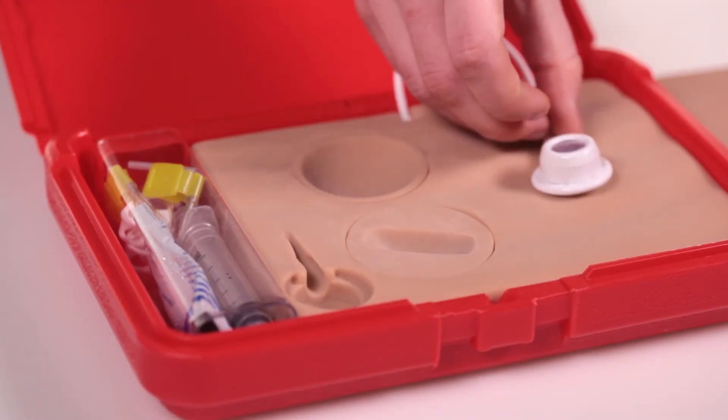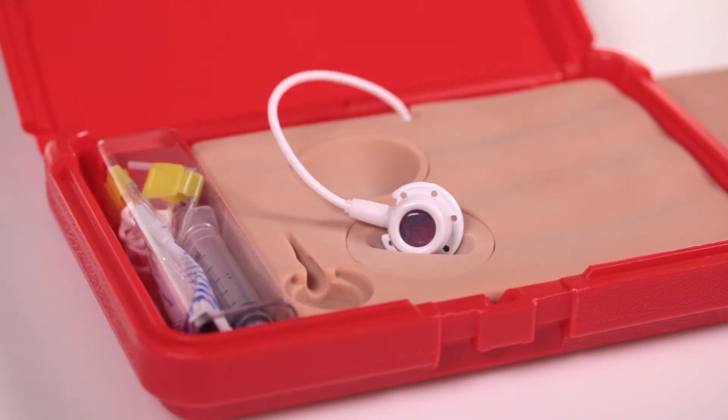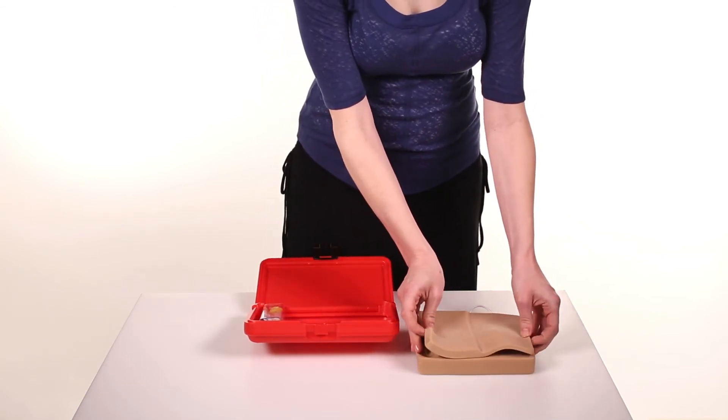Item 5022 simulates a tipped port by positioning the port in a tipped orientation. The inserts are interchangeable and the model can be accessed in the case or removed from the case.